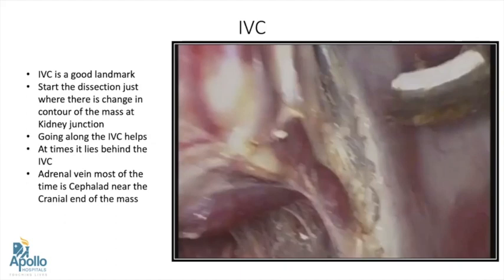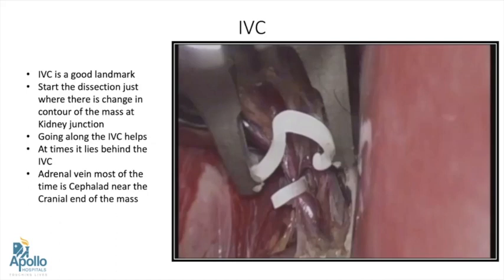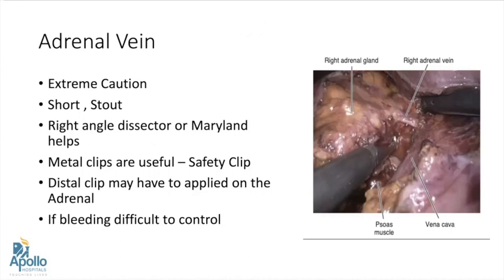As we ascend up, usually the adrenal vein lies in a more cephalad direction. In case of pheochromocytoma, as they are very vascular, we may see a lot of neovasculature as well. Those can be either clipped, cut, or an electrosurgical instrument can be used to take care of them. Coming to the adrenal vein, we should deal with it — especially on the right side — with extreme caution as it is very stout and drains directly into the IVC. A right angle dissector or a Maryland helps in their dissection. Metal clips are very useful and can act as safety clips. Distal clips may also be applied onto the adrenal. If bleeding is difficult to control, safety clips are very, very useful.